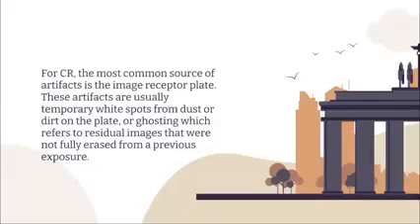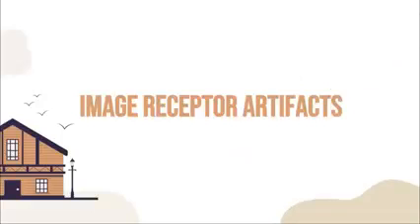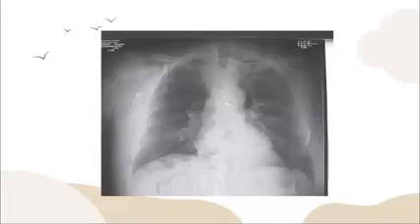Will require replacement of the image receptor. So, pag na-scratch ang inyong IP, pag aged na ang inyong phosphor, and pag mag-malfunction ang inyong pixels, most likely ang remedy ana is to replace the image receptor. Okay? So here are some of the image receptor artifacts found in CR and DR systems.